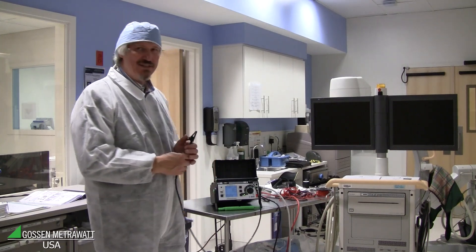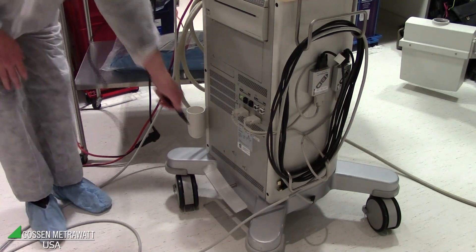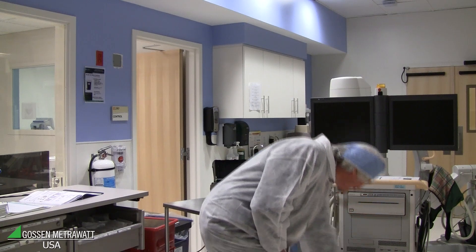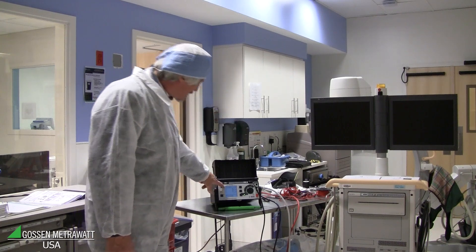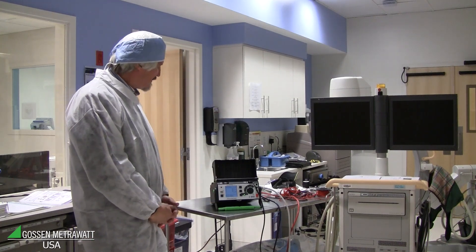To measure the touch current, we have to connect the probe on the housing of the equipment. For this kind of equipment, a good place is down here on the housing — it's very well connected. And you can see the touch current is near zero because all of the equipment is very well grounded.